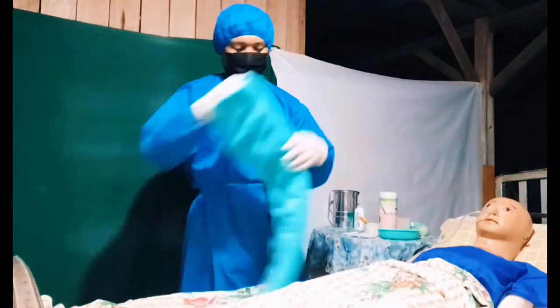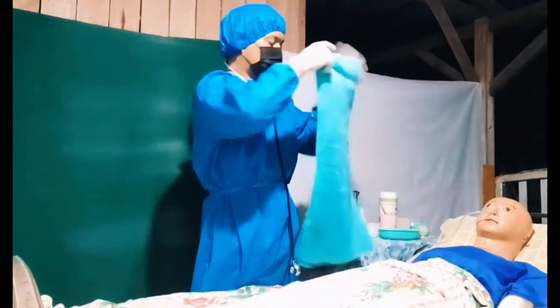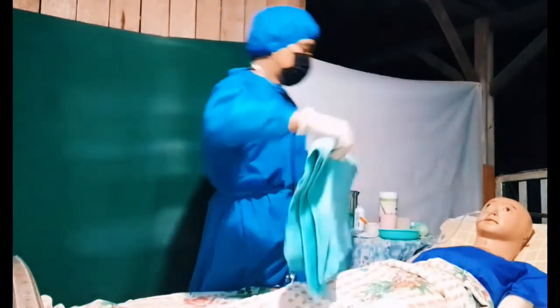Then, put the towel on her chest. Again, to avoid messing up the bed as well as the patient.